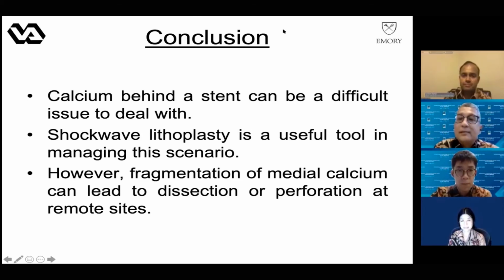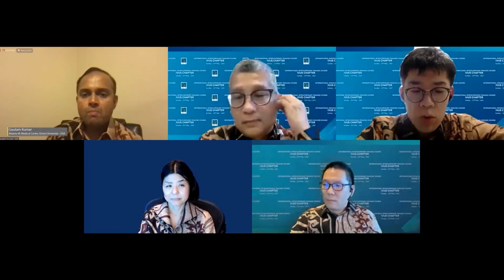Dr. Suki, may I ask you about this kind of lesion? Do you use the rotablator to correct this underexpansion in this situation? Yes, sometimes we do. Stent ablation is one of the options for the unexpanded stent. And we do the ablation with a very high rotational speed. And it takes a longer time than conventional ablation, I think. It's a good indication, I think.